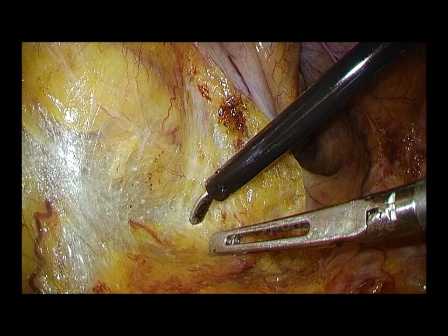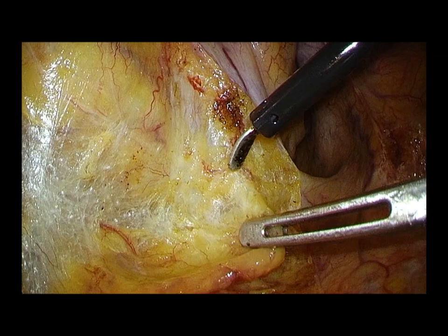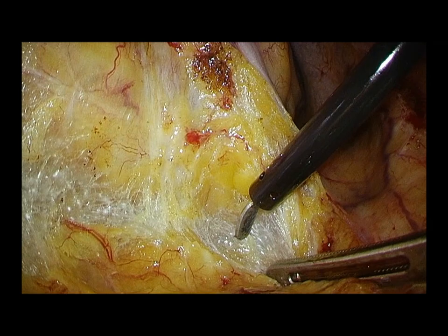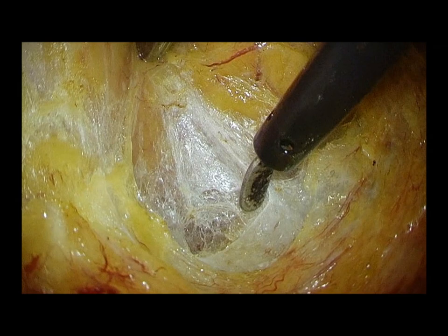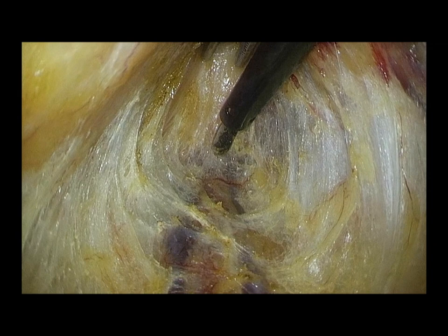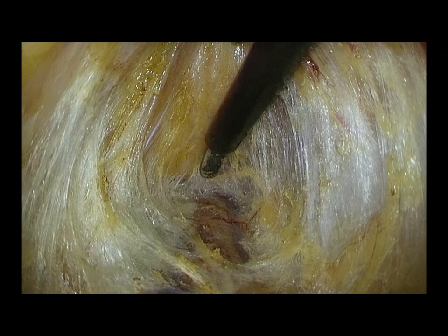The hypogastric nerves are identified and carefully preserved behind the rectosigmoid. The pre-hypogastric nerve fascia is incised and opened between the hypogastric nerves to enter the presacral space. The avascular presacral space is dissected as coldly as possible by sharp dissection.